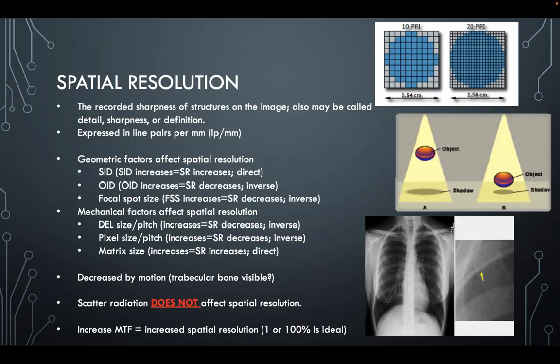However, when we get to matrix size, it's going to change. So as matrix size increases, so let's say, here we go, these lovely blue circles up here.